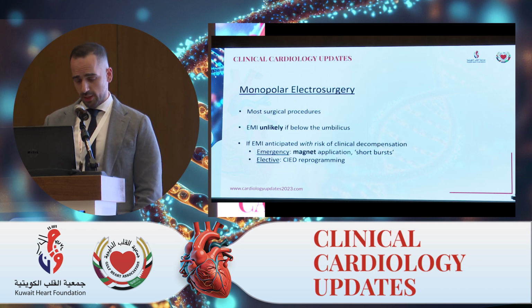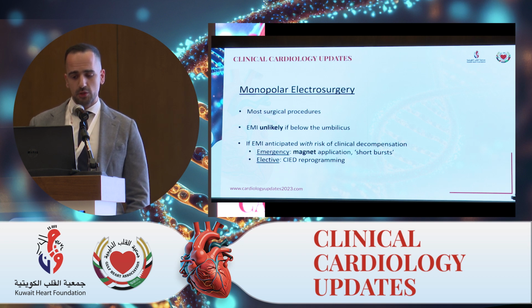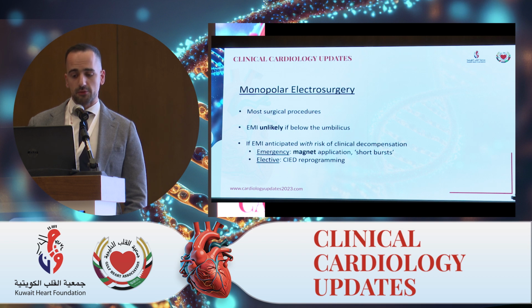Monopolar electrosurgery is the most common type of electrosurgery or cautery that is used. Bipolar surgery, which is only used in ophthalmologic or certain vascular surgeries, is not usually a source of EMI, but when you're using monopolar surgery, there's a return patch, electricity will course through the body, and it's considered a source of electromagnetic interference. It's unlikely, however, if it's below the umbilicus, so lower extremity surgeries are usually not a concern.